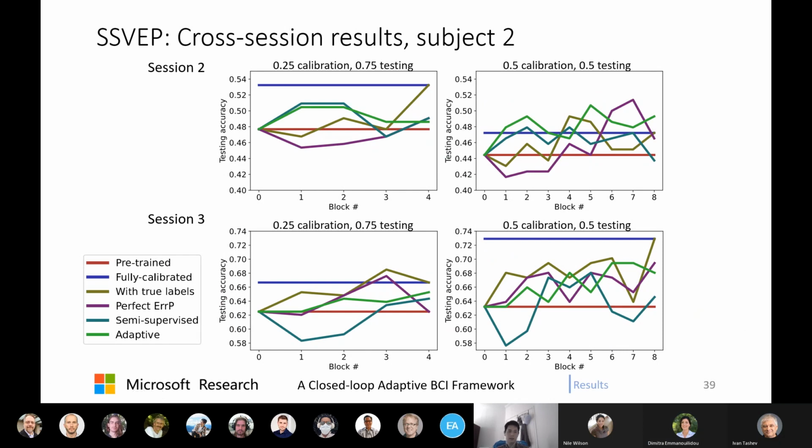So I believe there's variation here every time the headset is put on a subject. When I myself was the participant, I can better control the EEG headset. I guess it will be more robust when I put it on myself, because I know the limitation of how much pain I can endure, and how deep the electrode can be put.